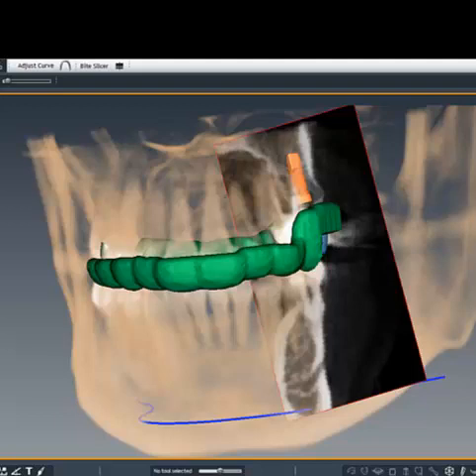with all the various modules that we have in the step-by-step approach on bioengineering and implant, which is a root form, an emergence profile of the abutment, and the final prosthetics top-down analysis of the entire case before we actually start.